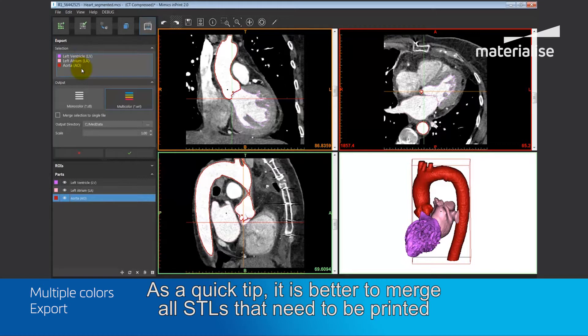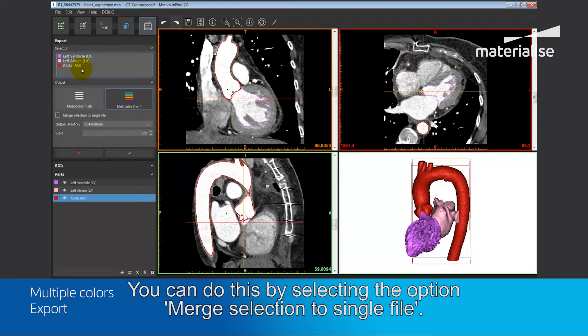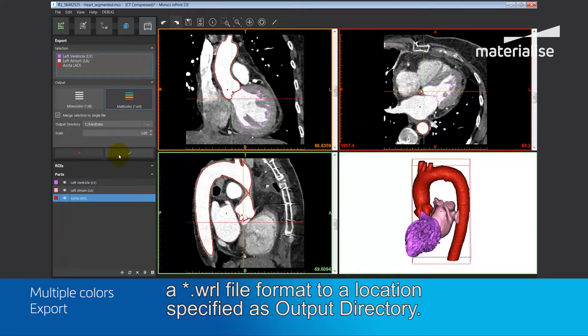As a quick tip, it is better to merge all STLs that need to be printed in the same color as it makes it easier to upload the STLs for printing. You can do this by selecting the option Merge Selection to Single File. Once you select the OK option, the green tick icon, the parts will be exported in a .wrl file format to a location specified as the output directory.